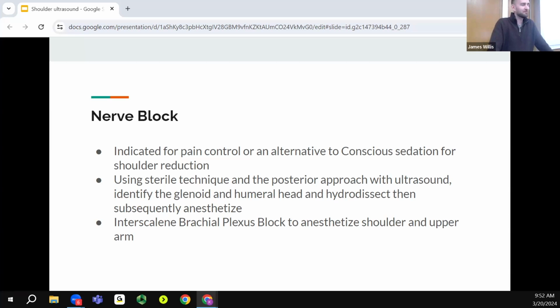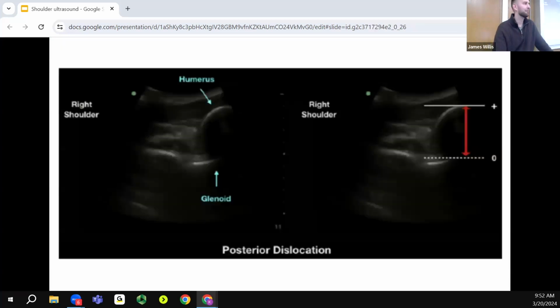What about posterior dislocations? How is ultrasound looking for that? What are the operating characteristics of that? Or sensitivity, specificity, I would assume they're very similar to anterior, but I didn't look at any studies. They're very rare. It's not a lot of lightning strikes. When they pop in, it's usually very easy to appreciate.